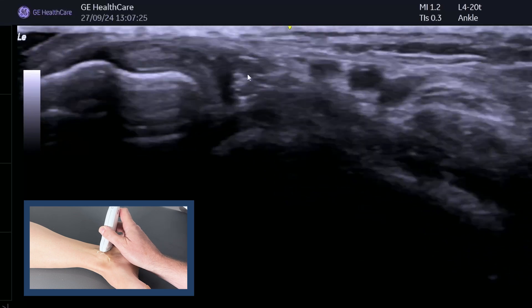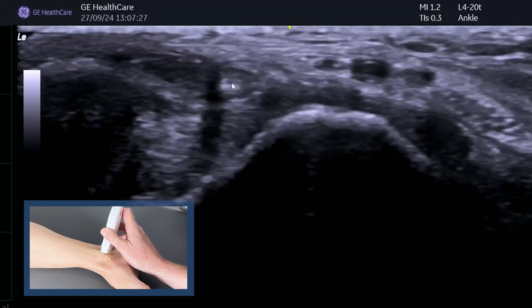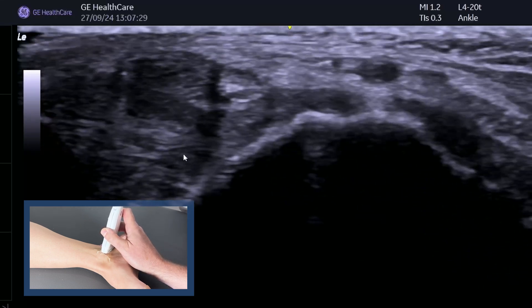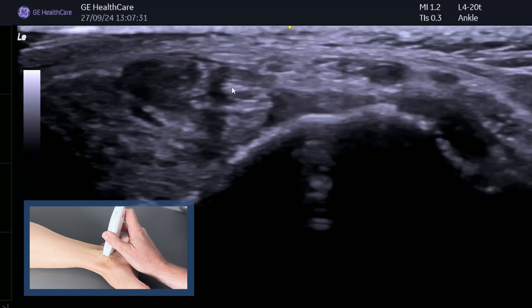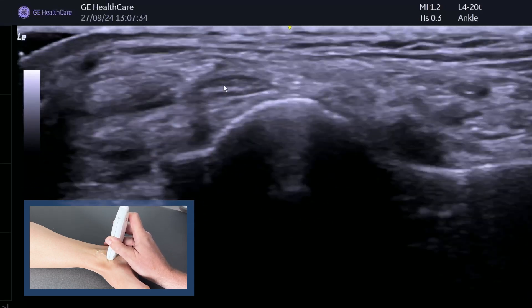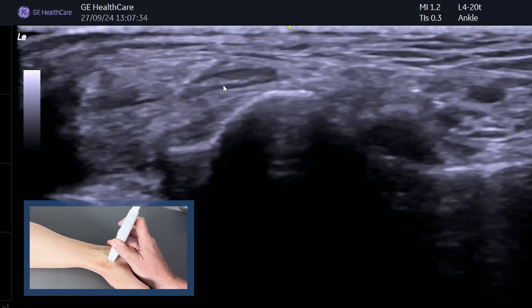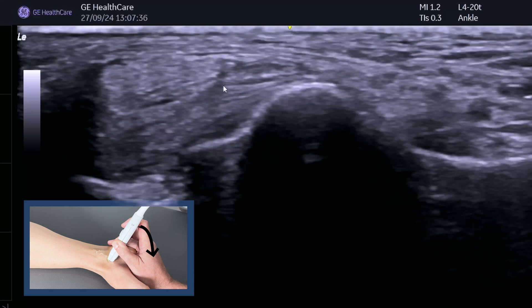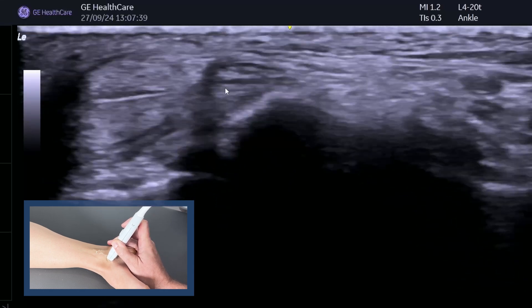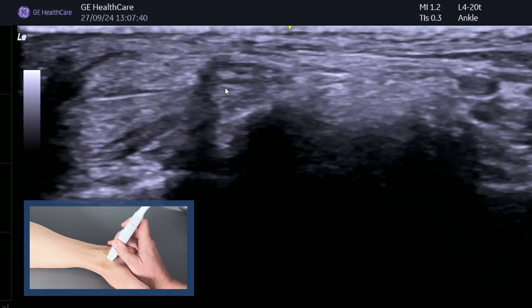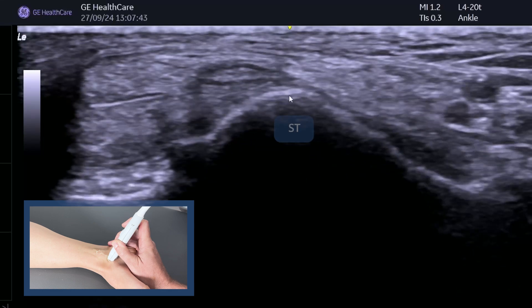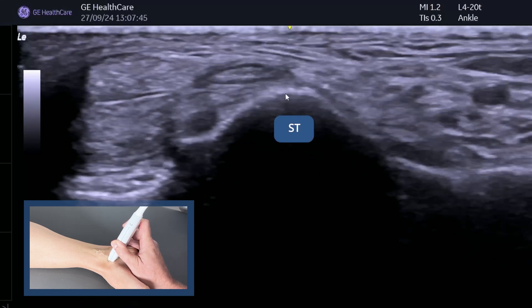Just keep an eye on the FDL. You can see the deltoid ligament nicely. FDL is a small tendon and it will go dark about now. Make sure you're tilting your probe up into the foot to get a nice image. This is FDL. This is the sustentaculum tali — that's an important landmark to look out for.